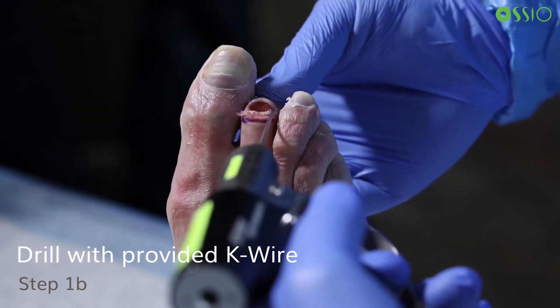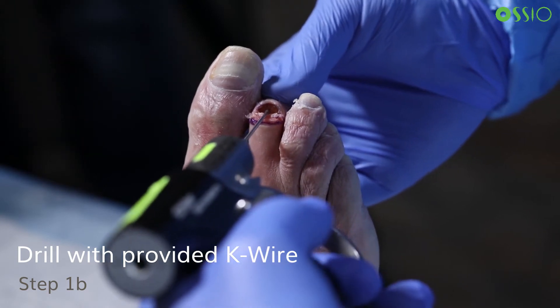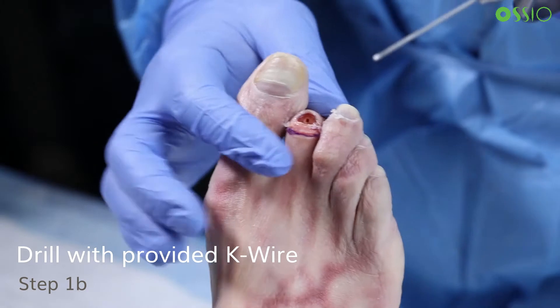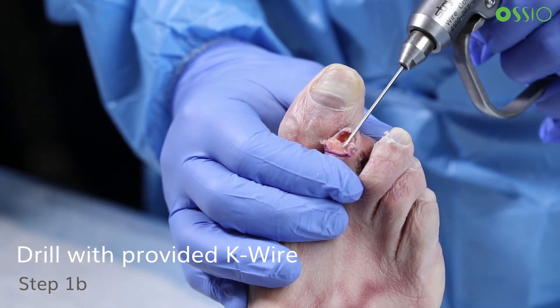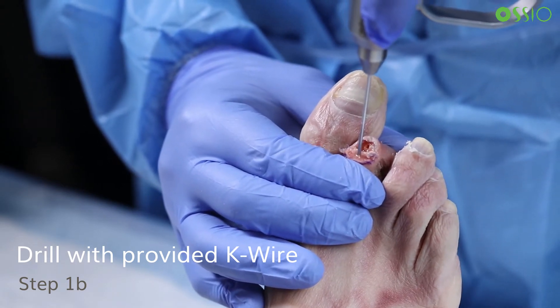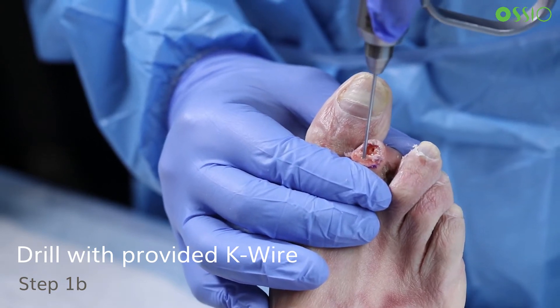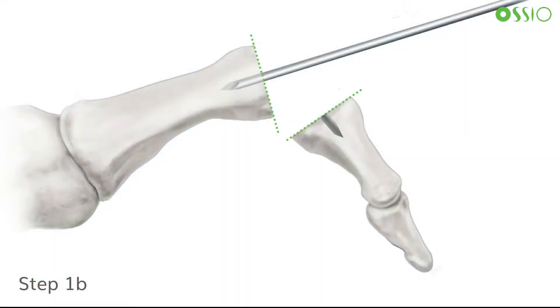It is then recommended to drill a pilot hole with the provided 1.6 millimeter k-wire in the proximal and middle phalanx parallel to the dorsal cortex. This facilitates a centering tunnel within the canal and prevents the drill bit from skiving. Drilling to the depth of the opposite cortex or approximately one centimeter is sufficient tunnel length. If there is any deviation, removing and re-drilling the k-wire is an option. Fluoroscopy can be utilized to confirm appropriate trajectory at the surgeon's discretion.